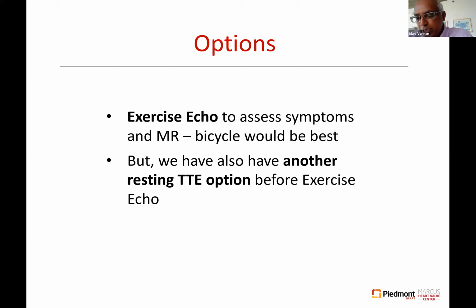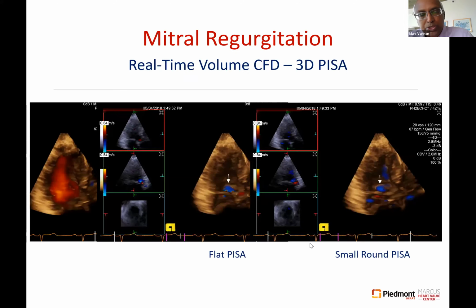To do it by 2D TTE would be one option, but that is not easy to do, nor is it reliable. If you only do it once in a while, you're not going to be good at it. If you're going to do this, you ought to be doing it almost every day, at least in a few patients, so that you're good at it, and more importantly, you believe the numbers.